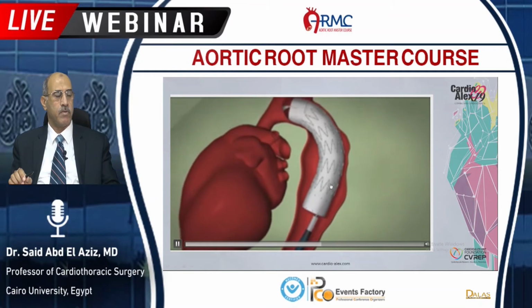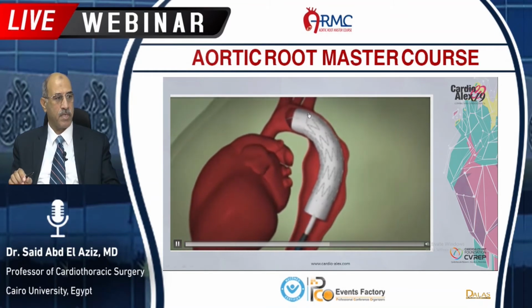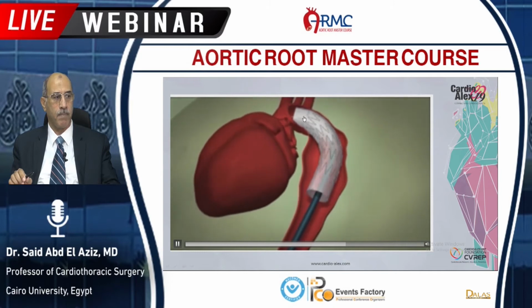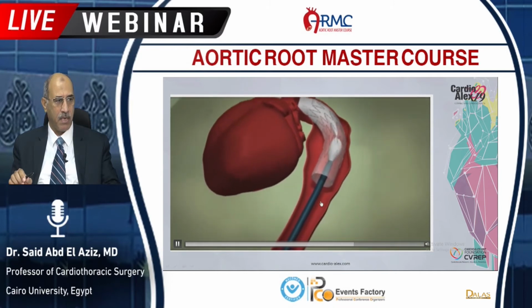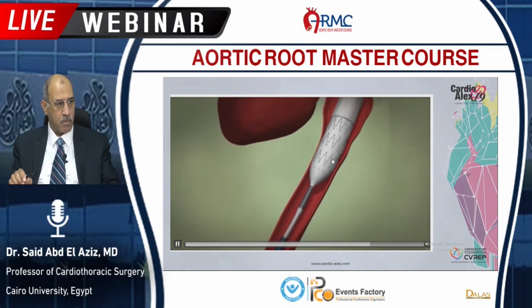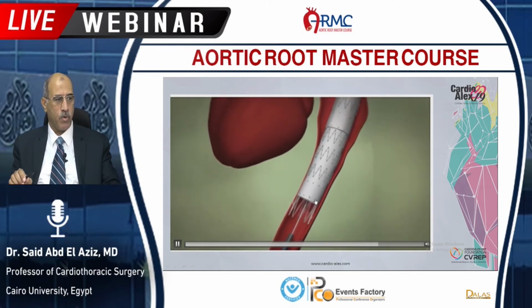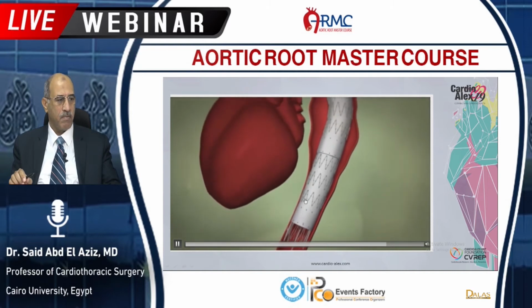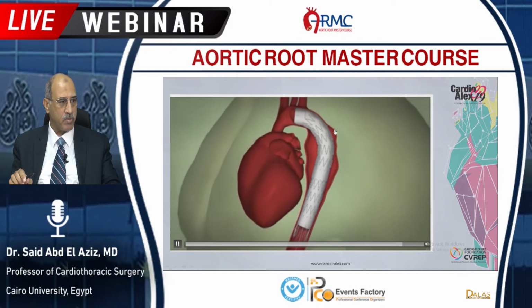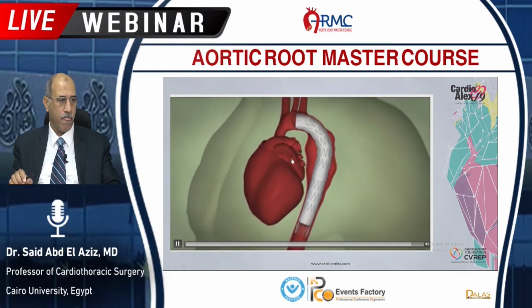In that video, we need another stent because this is a landing zone in the proximal part, but here we still need a landing zone down in the descending part, so we put another stent. So we excluded from here the landing zone down and landing zone above. We excluded this aneurysm.